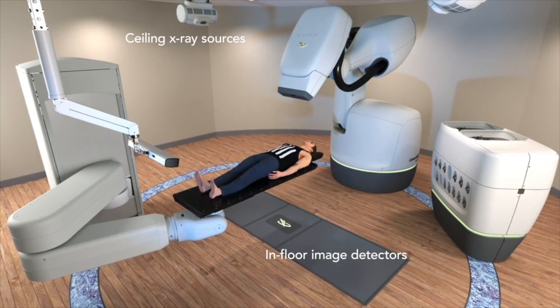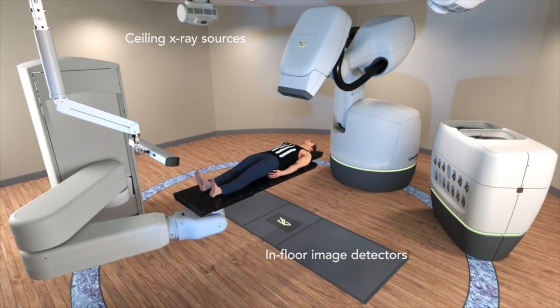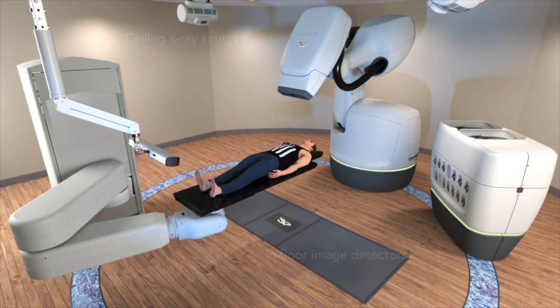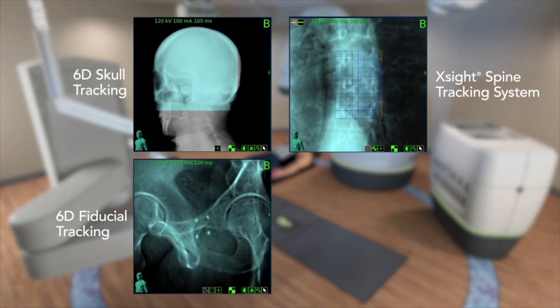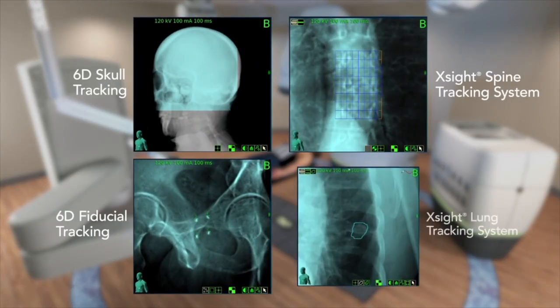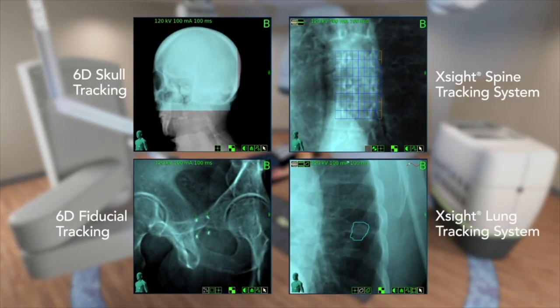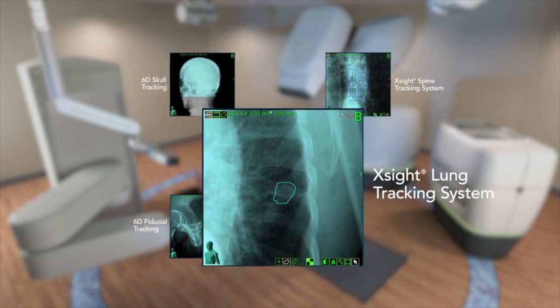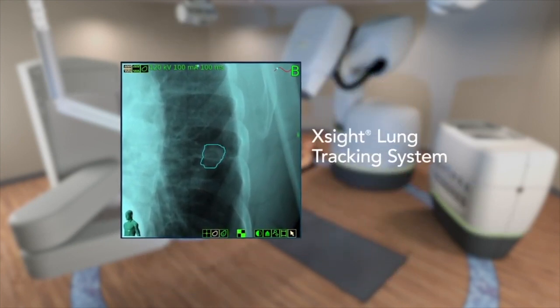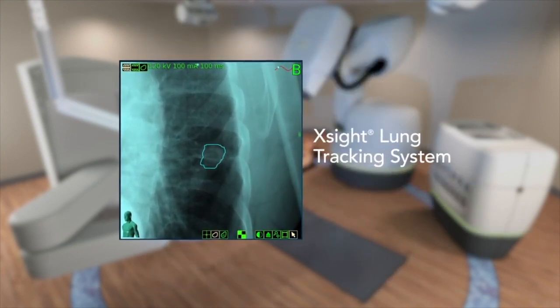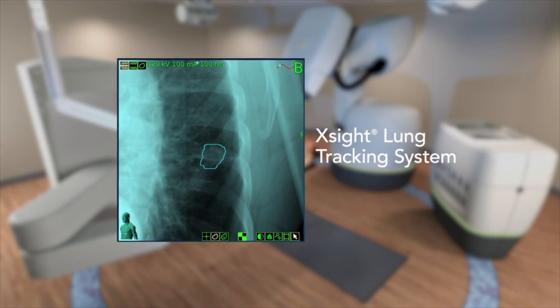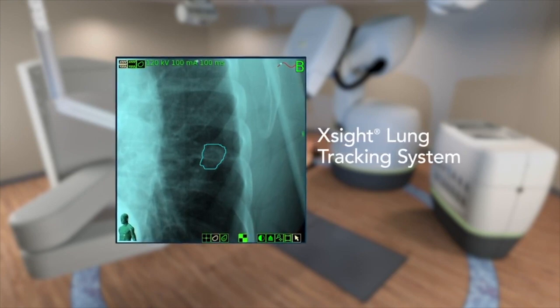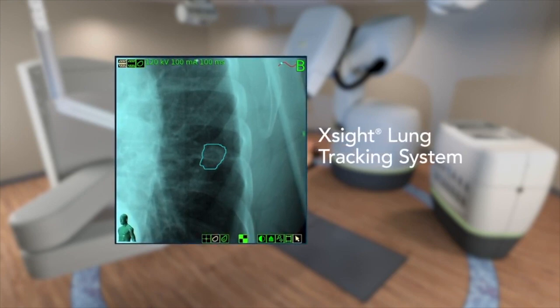The CyberKnife system uses specialized tracking algorithms to track the skull, the spine, fiducials, or the tumor itself depending on the target location. For lung tumors, the Xsight Lung tracking algorithm can distinguish the tumor from the surrounding lung tissue.